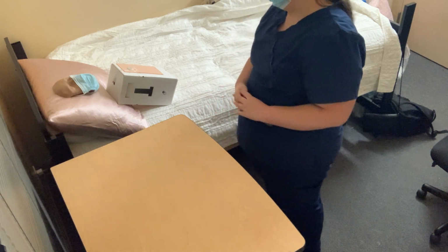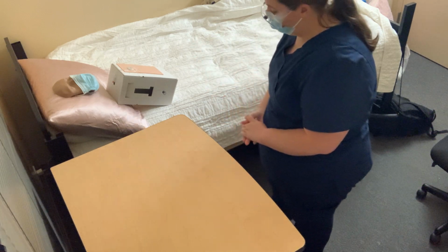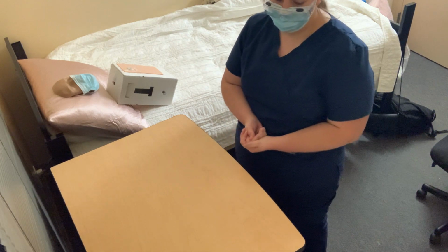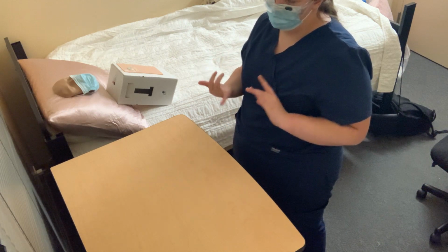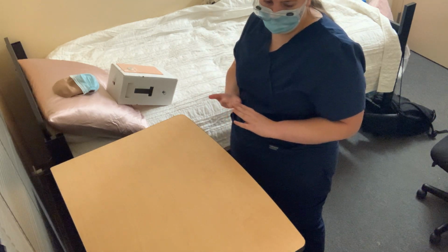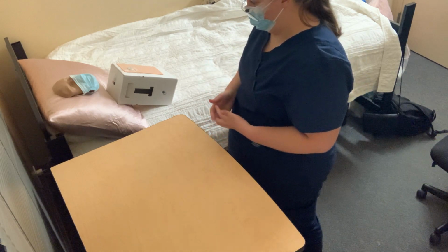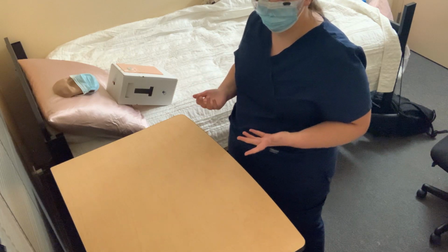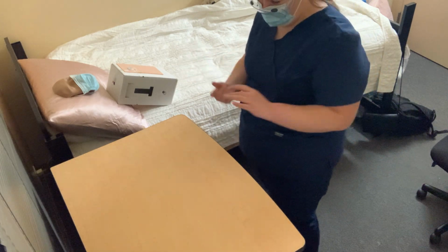So I just need to document the assessment and the steps that I just did, and then I'll be out of your way. Okay, so I'm going to document the date and the time that I changed the dressing, as well as my assessment of the site, that there were no signs of infection, no swelling, no redness, no drainage, no bleeding. Also, my assessment of the tubing not having any cracks and not having migrated. I'm also going to document that the patient was able to tolerate the procedure without any pain or discomfort. And that finishes my documentation.